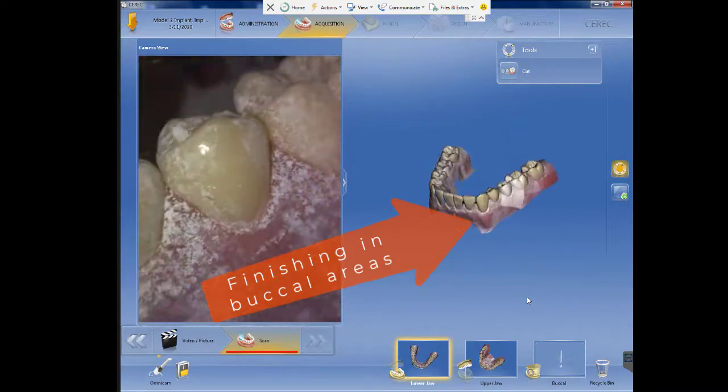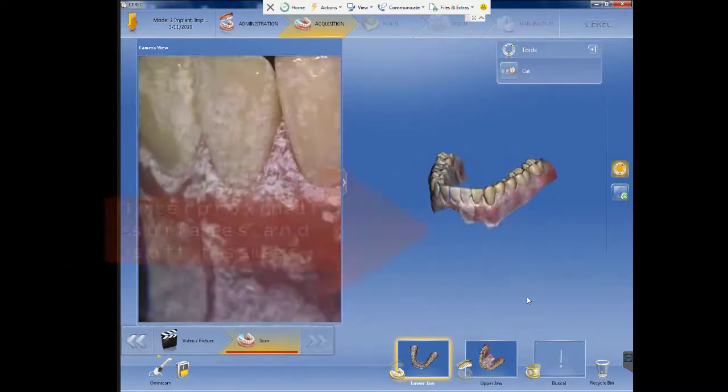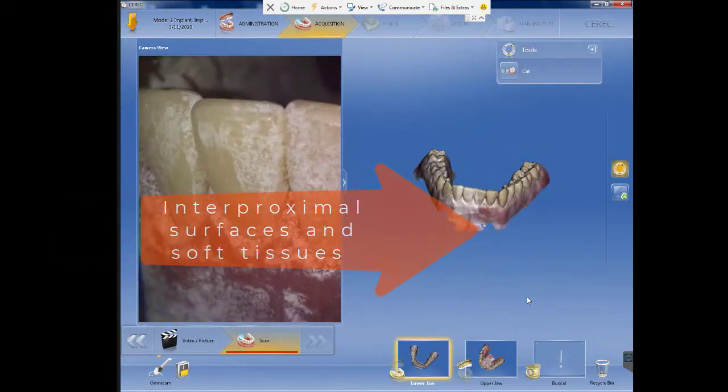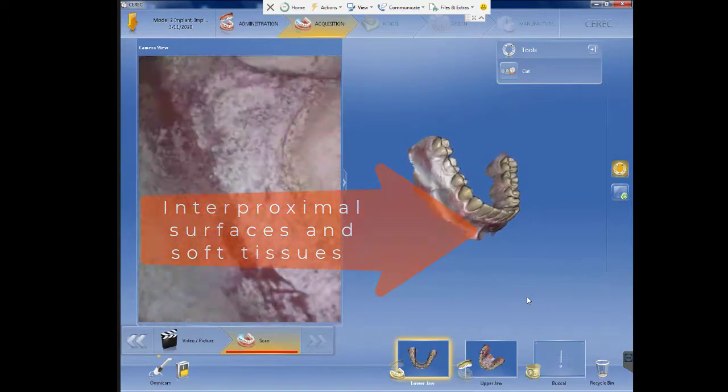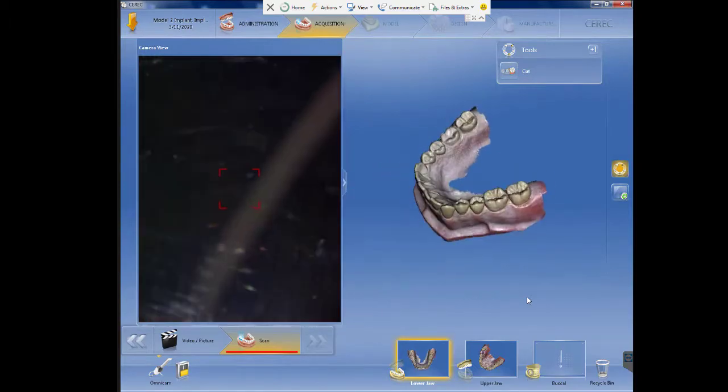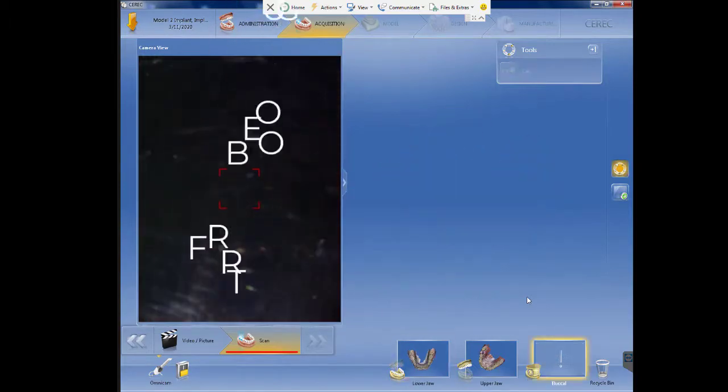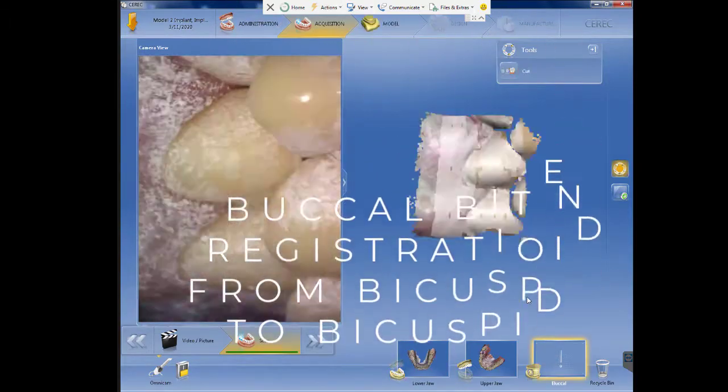Once this is done you will check all the interproximal surfaces and soft tissues. This way you will have a solid model.